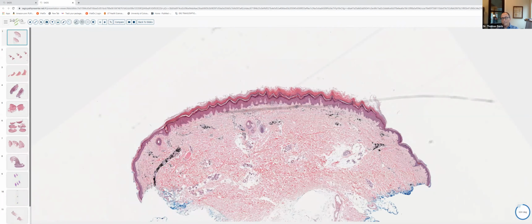And of course, silicone can be injected in a variety of locations for tissue augmentation. Occasionally, we'll see leaking breast implants, and the silicone will leak out into the dermis and have an appearance very, very similar. But these variably sized vacuoles surrounded by macrophages, and at times fibrosis, are very, very characteristic of silicone, and it generally doesn't produce too much of an inflammatory response. Some people can be very sensitive, and occasionally you can get more of an inflammatory response of granulomatous inflammation, but this appearance is very characteristic of silicone.